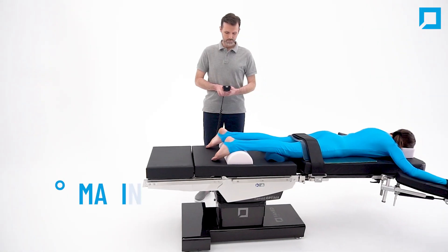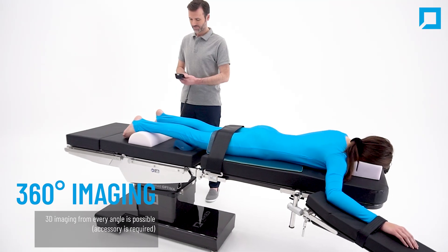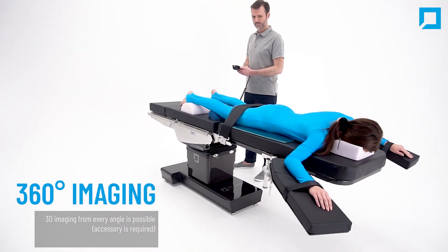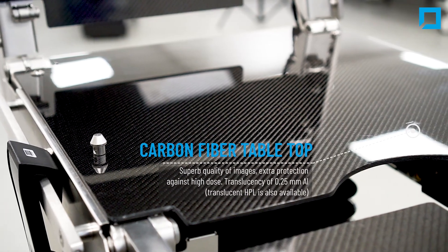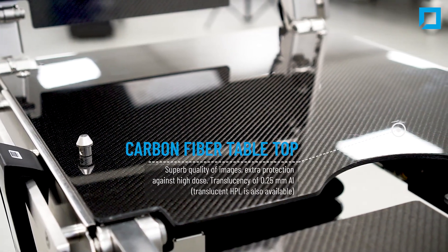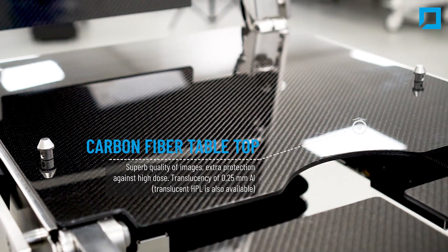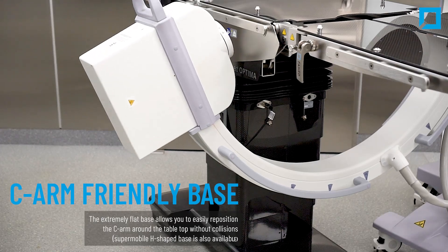It is 360 degrees imaging ready. Using a C-arm and the Optima table, you can make 3D imaging from every angle. The carbon fiber tabletop offers superb quality of images, with a translucency of 0.25 millimeters aluminum equivalency and extra protection against x-rays for hospital personnel.